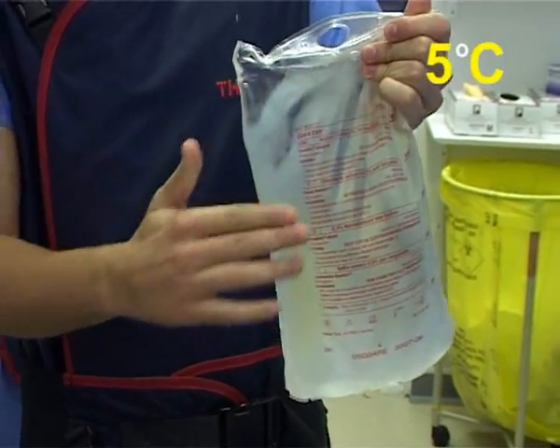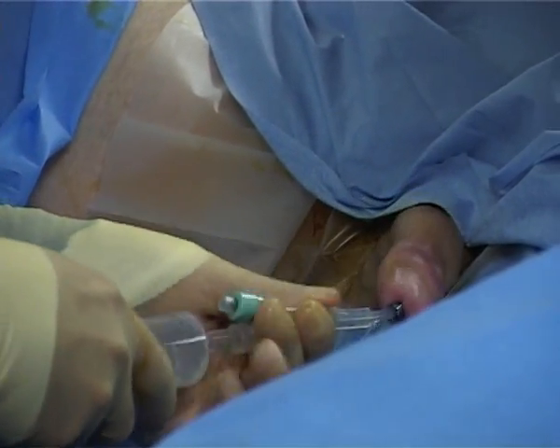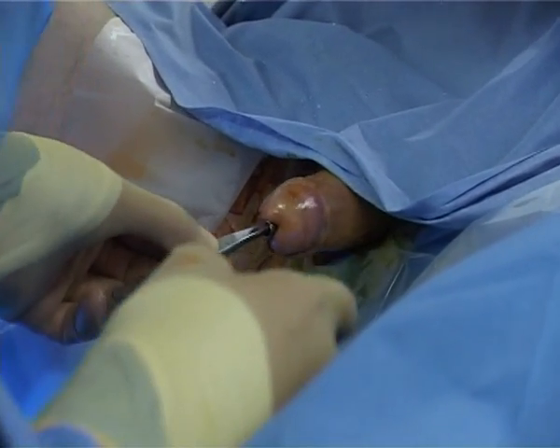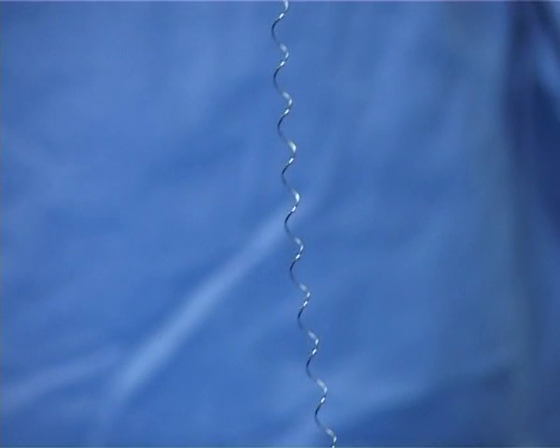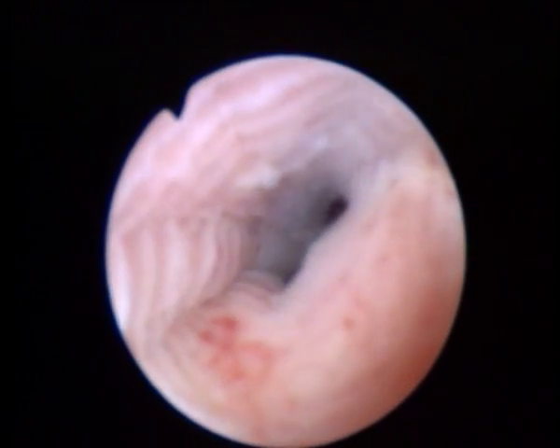Cold saline is inserted via urethral catheter to soften the Memocath stent. The distal Memocath is removed with forceps. It uncoils completely and is removed atraumatically. Flexible cystoscopy demonstrates the healthy underlying dilated urethral epithelium.